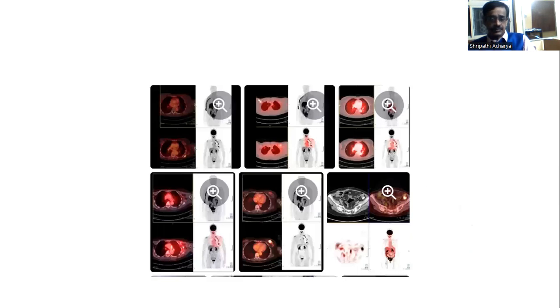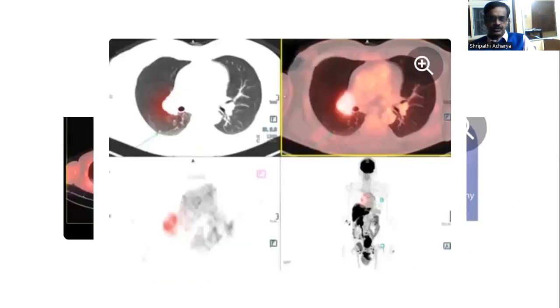This is another picture where the PET scan pictures are there in the horizontal plane as well as in the frontal plane. So you should have the normal structure, anatomy, first. Then you can compare the film and find the pathology. Here you see on the side, there is a tumor, and clearly there are PET scans.